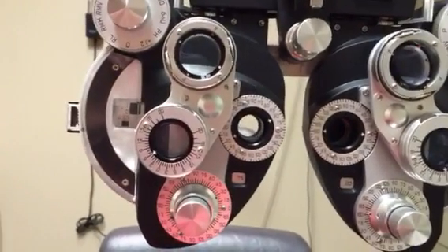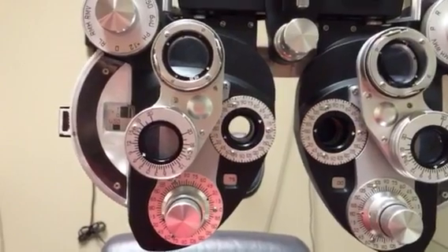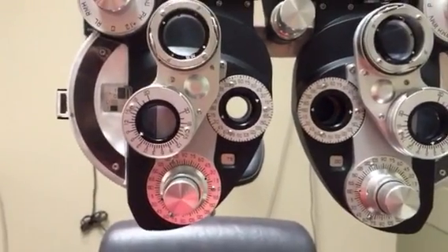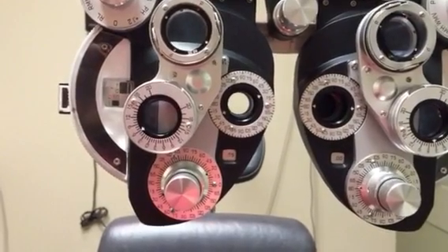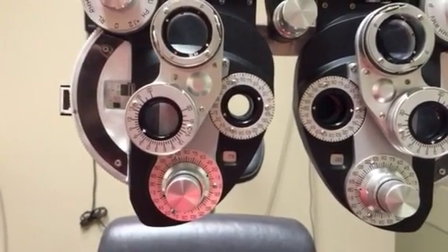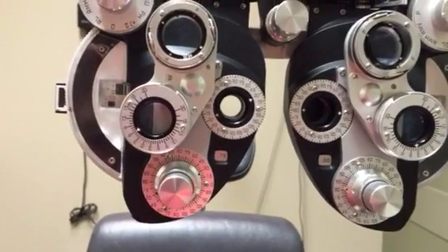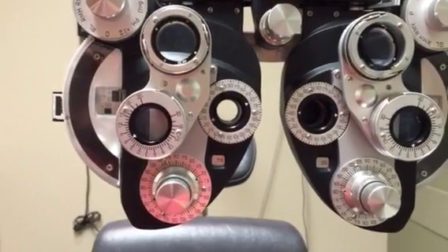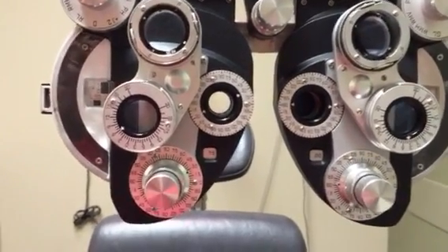There's also another technique called fogging, which is a way to double-check your prescription. It's especially useful for younger minus patients who are easy to over-minus, and for latent hyperopes where you're unsure the sphere power is correct.